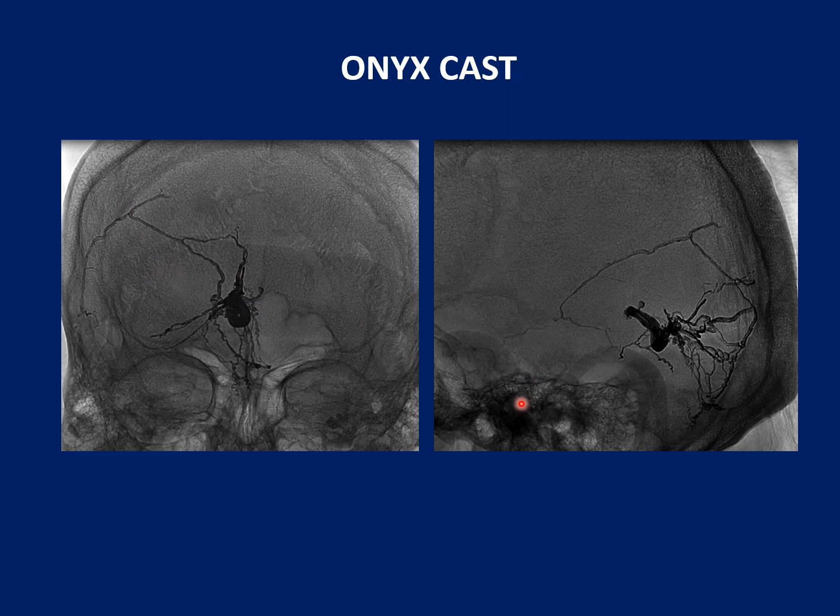So through the middle meningeal artery, this is the petrosquamosal branch. This is run here distally. The microcatheter was lodged here. Longer route, but easier to go when compared to the transosseous, because this part of the skull cannot be negotiated if you go through the occipital artery. So it appears to be a smaller route.